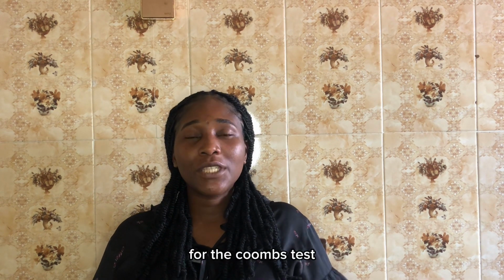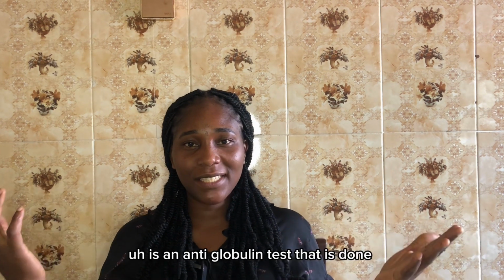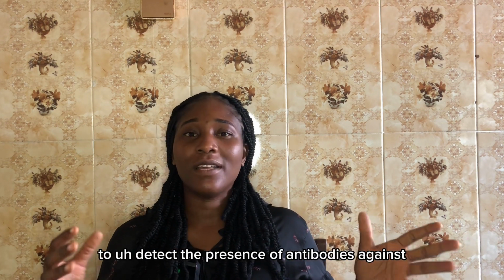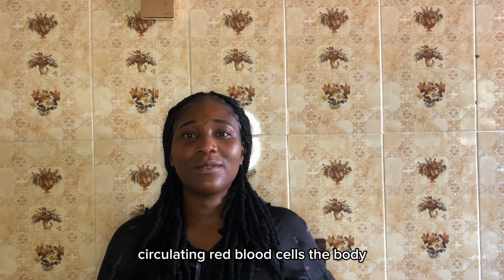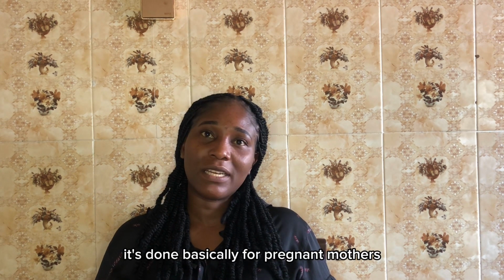For the Coombs test, Coombs is an antiglobulin test that is done to detect the presence of antibodies against circulating red blood cells in the body, which then induces hemolysis. Do you get? It's done basically for pregnant mothers.